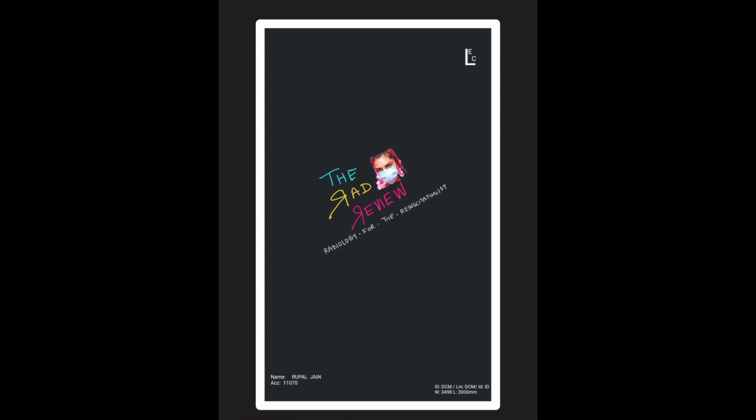We are discussing radiology for the resuscitationist. My name is Rupal Jain from the University of Maryland School of Medicine, and this is episode number 8. I decided I wanted to address the CT perfusion confusion.